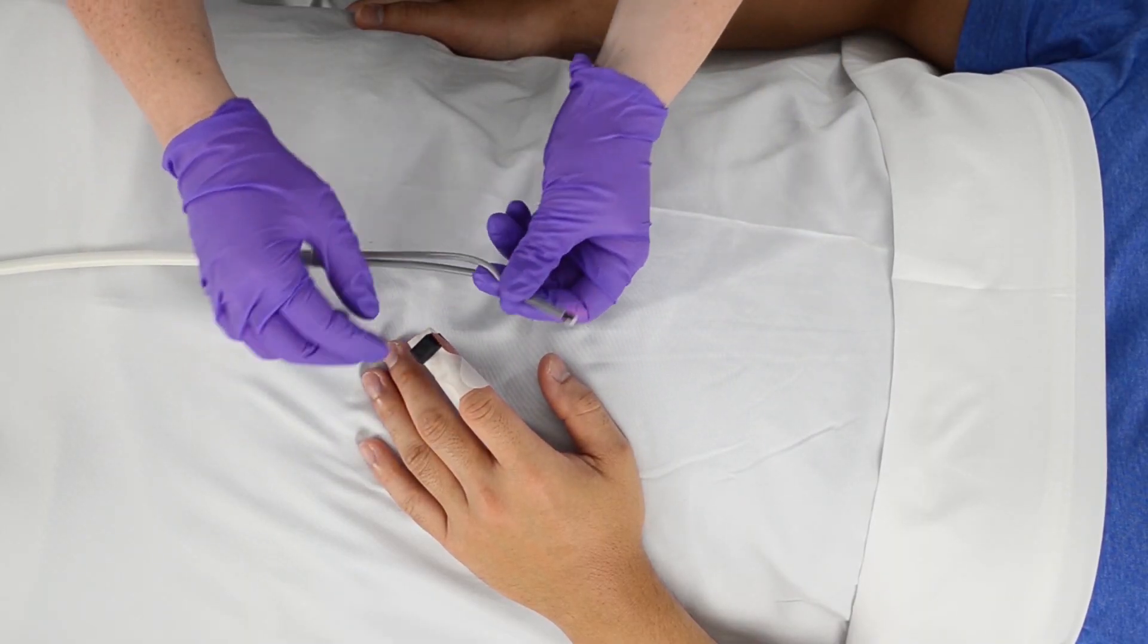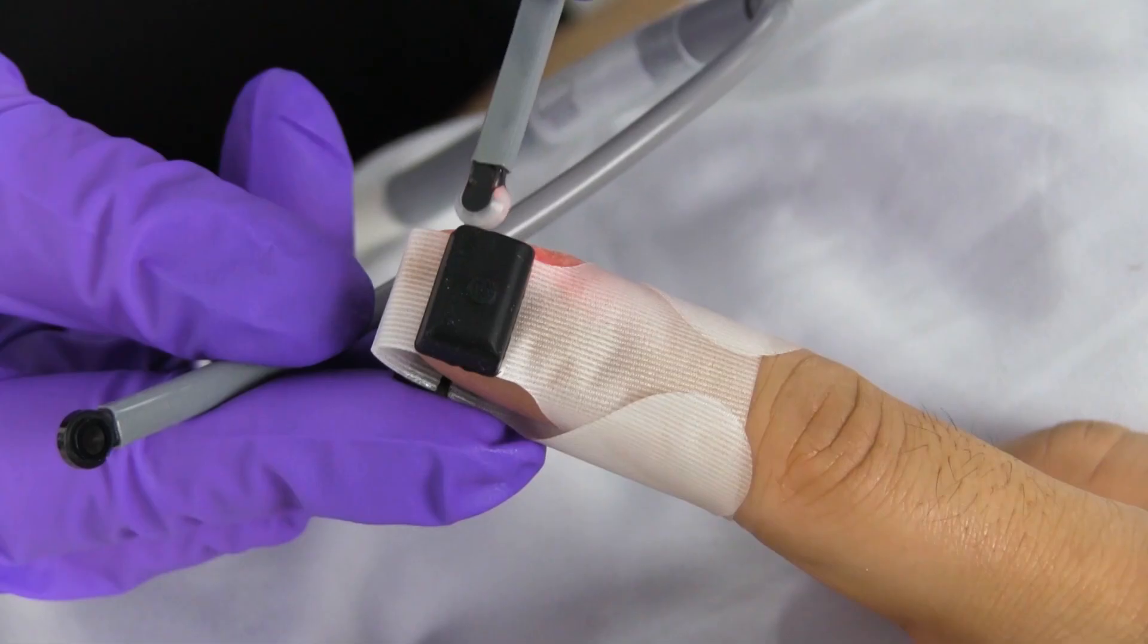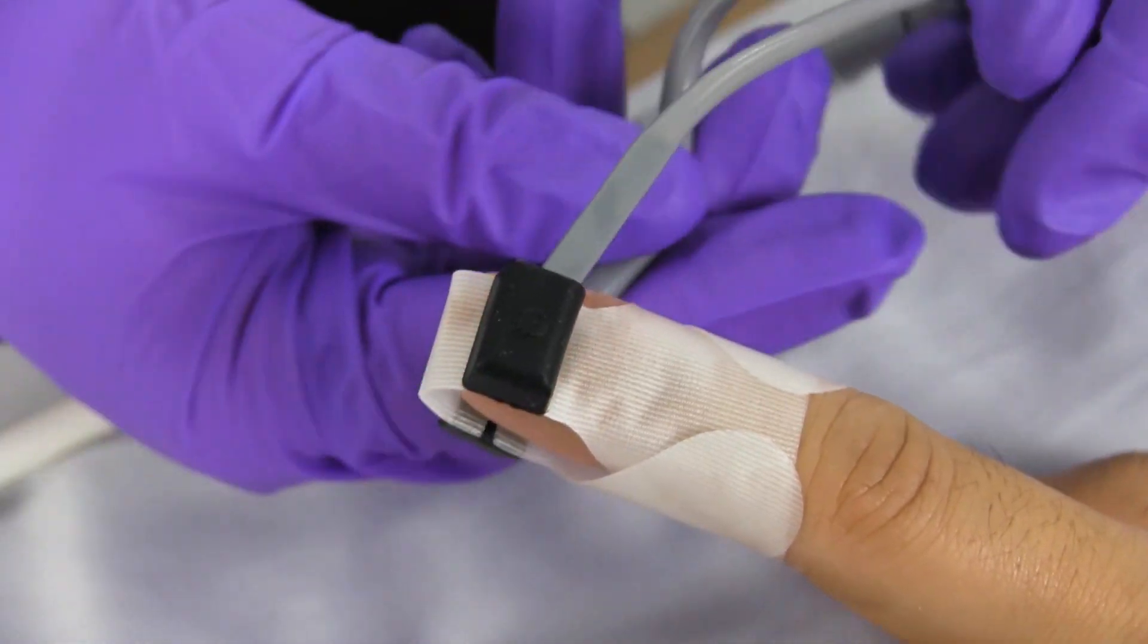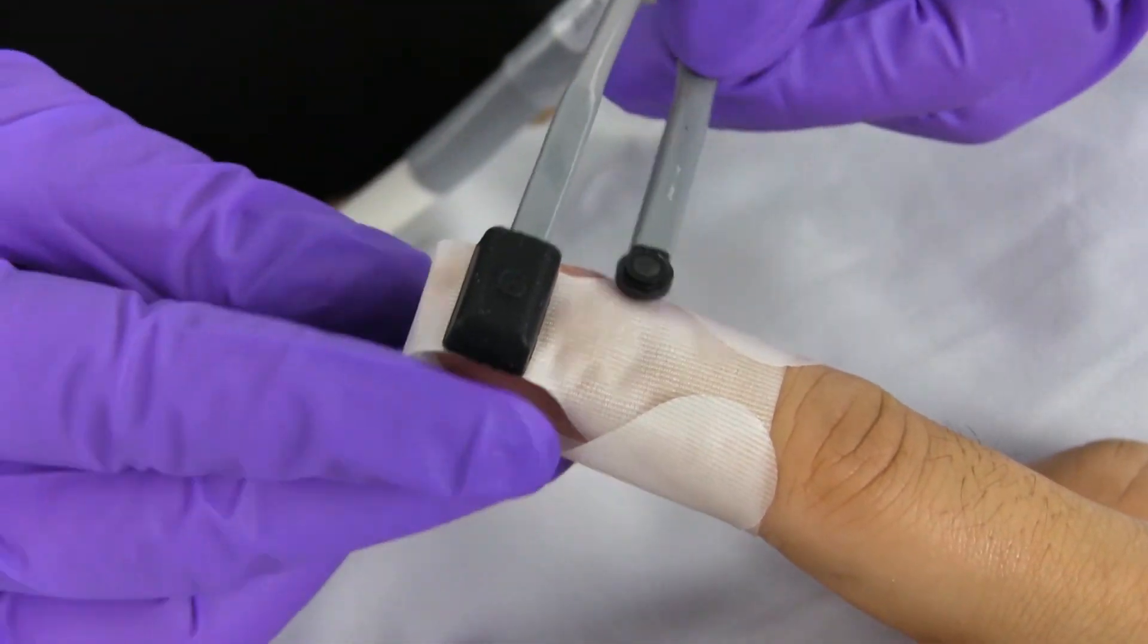The user must be sure the grips are secure as to avoid poor readings. The user needs to ensure they do not wrap too tightly and check circulation after applying the grip to the patient.